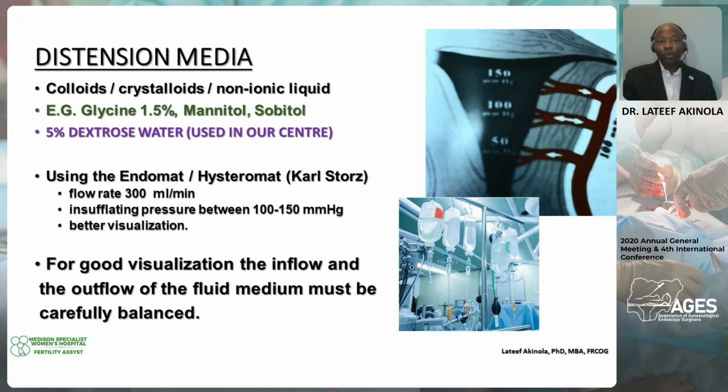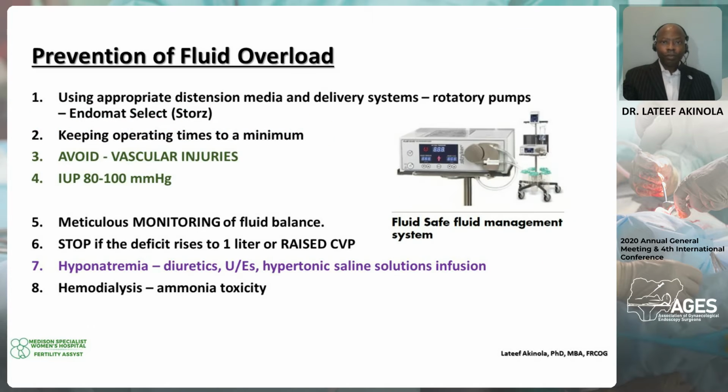You regulate the flow rates. You can also regulate and keep constant your intrauterine pressure. The fluid distension media also give you a better visualization as well, and you can carefully examine the cavity and do your treatments.